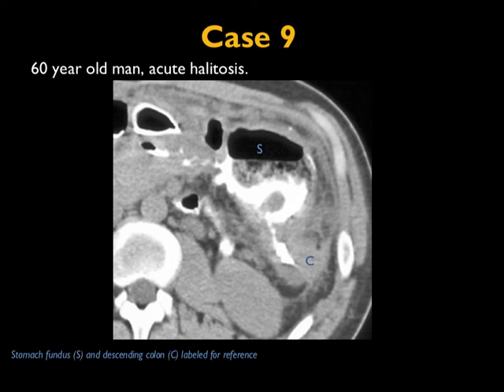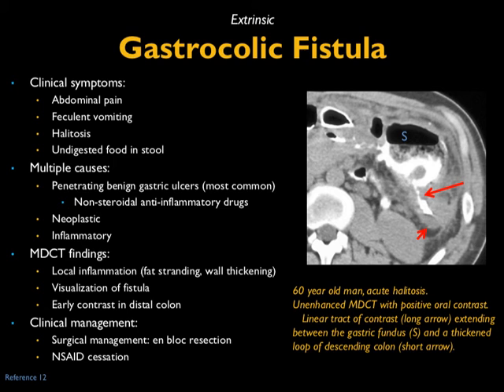Another case: patient with severe halitosis. Because of the halitosis, there was concern about a fistula to an adjacent organ, which is why positive contrast was given. You can see very nicely a fistula between the stomach and the colon — a so-called gastrocolic fistula. Patients present with a range of symptoms including abdominal pain, fecal vomiting, halitosis, and undigested food in the stool. Penetrating gastric ulcers are the most common cause, but it can also be due to inflammatory or neoplastic processes in the colon — more commonly a primary colon process than a primary gastric one. Local inflammation, fat stranding, and visualization of the fistula are the CT findings. These patients will benefit from surgery.